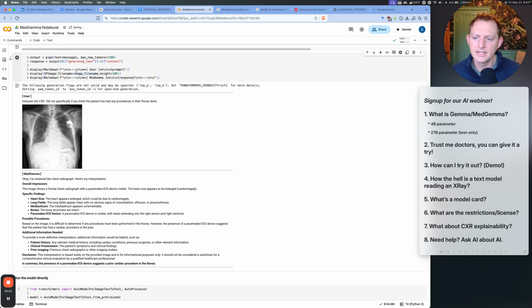The other thing that I think is interesting to point out is, how is a large language model actually interpreting images? So think of this model as like calling on a buddy, a friend that's a really good chest X-ray interpreter. So the large language model takes your prompt and then kind of consults a radiology model and says, "Hey, this Dr. Walker wants a chest X-ray read.